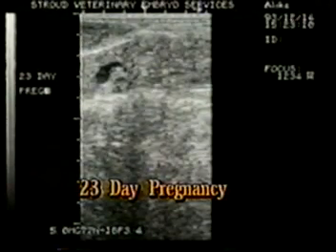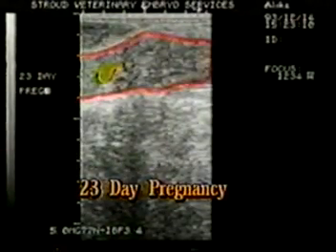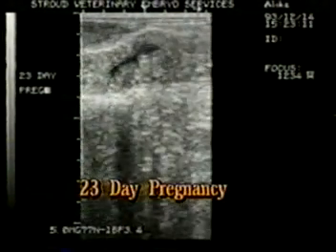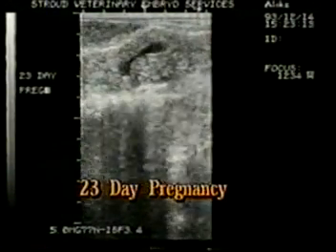The yellow represents amniotic fluid. The red line outlines the uterus. Positioning the uterus via rectal palpation is helpful, so the transducer systematically scans the entire uterus. However, one must use caution and not be overzealous in doing so, or embryonic death may occur.